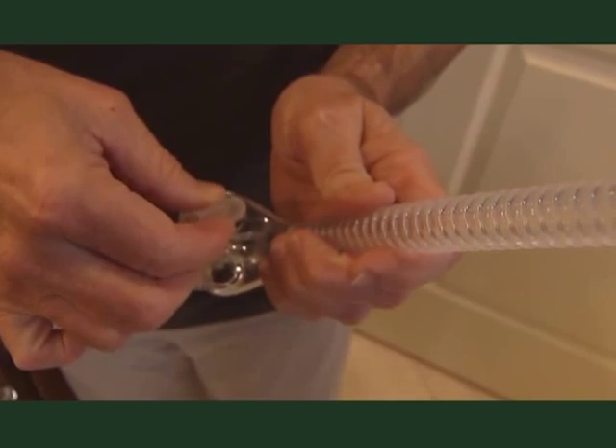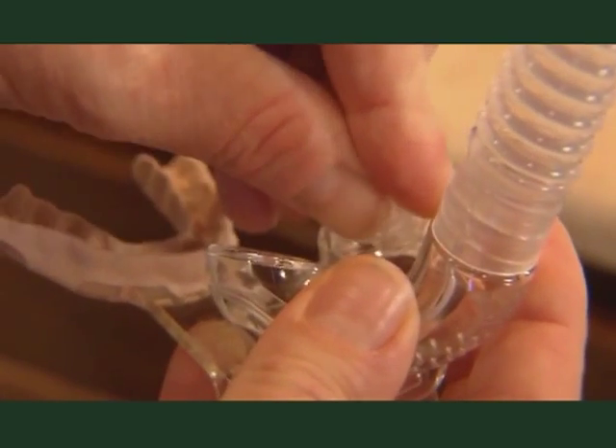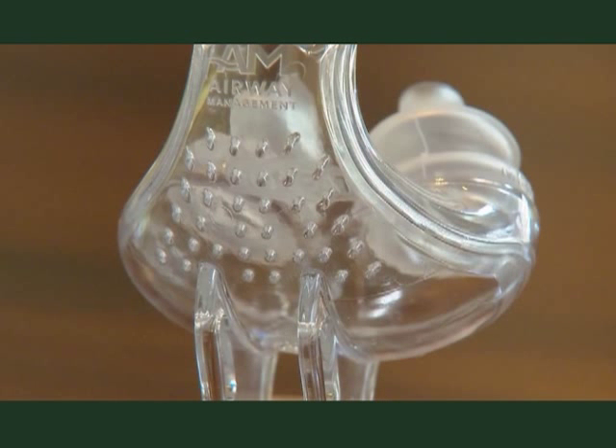Before use, reassemble the mask. Always check for any damaged components that may need to be replaced for proper function. Check that the vent holes are clear and free of any obstruction.